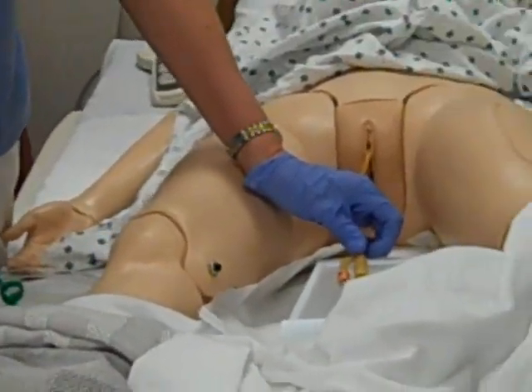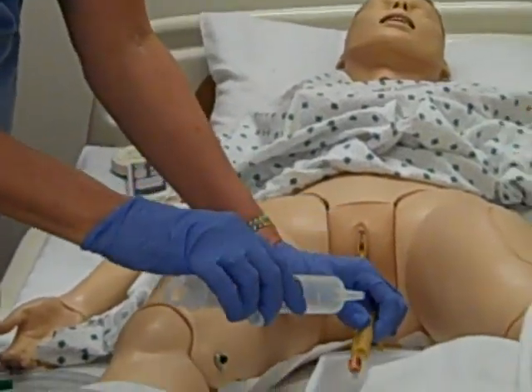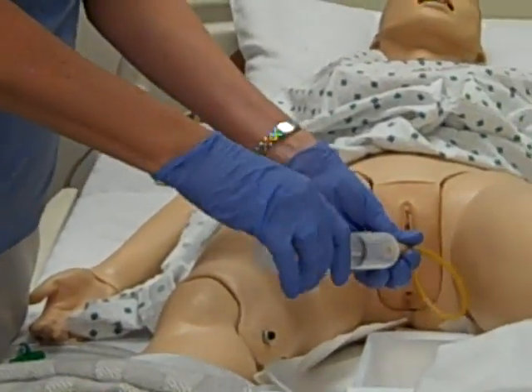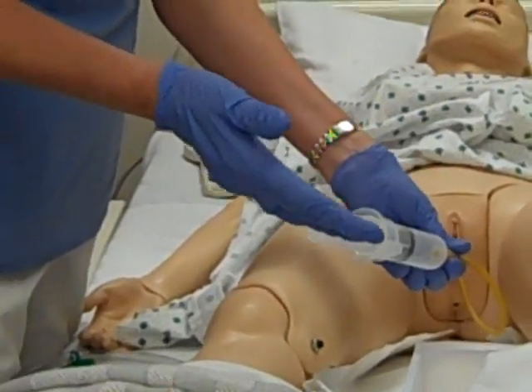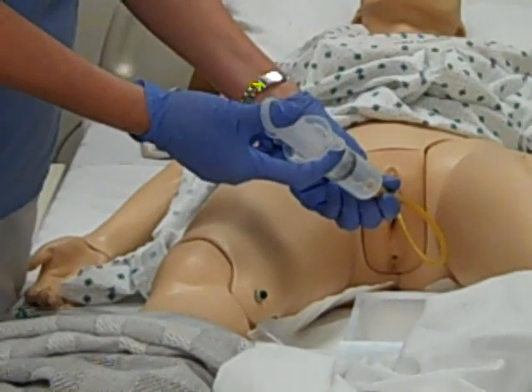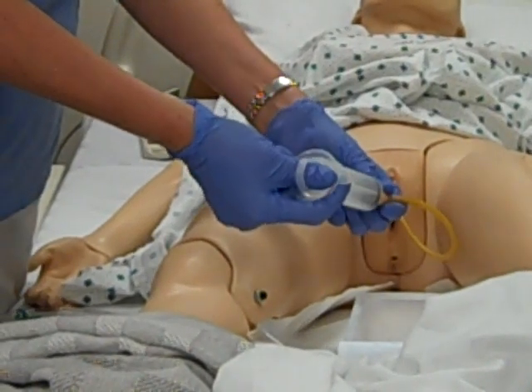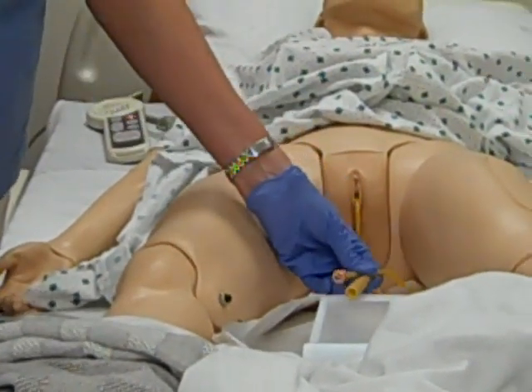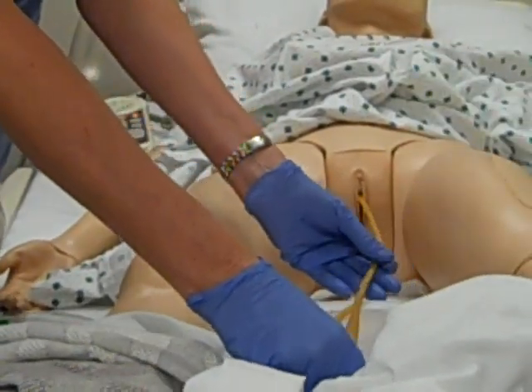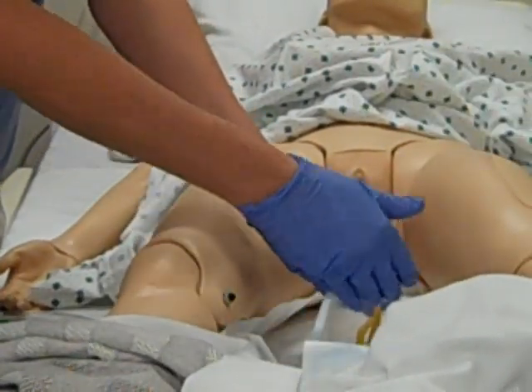Now we can go ahead. Your Smith & Dewell says to aspirate first, which you can do — go ahead and aspirate, see if you get anything back, and we don't. So there's a plug in there of some kind of clot or something. Go ahead and instill your saline. Take the syringe apart and just rest it on the side of your tray — you don't want it down into the tray because that would contaminate it. Keep it on the edge of your tray.